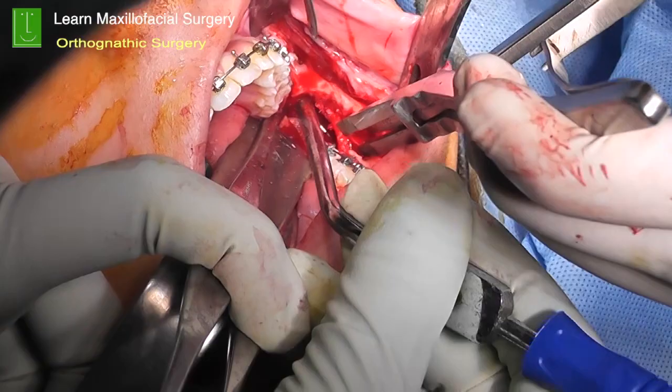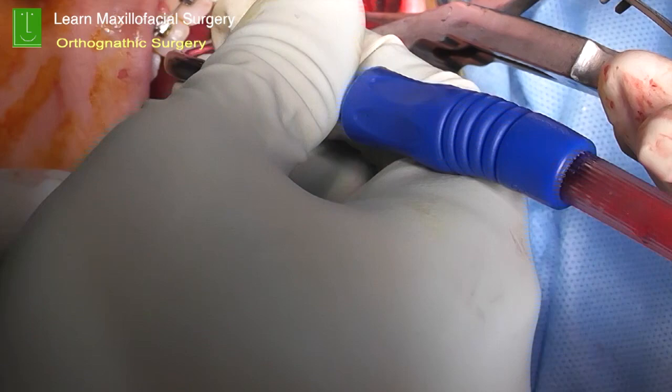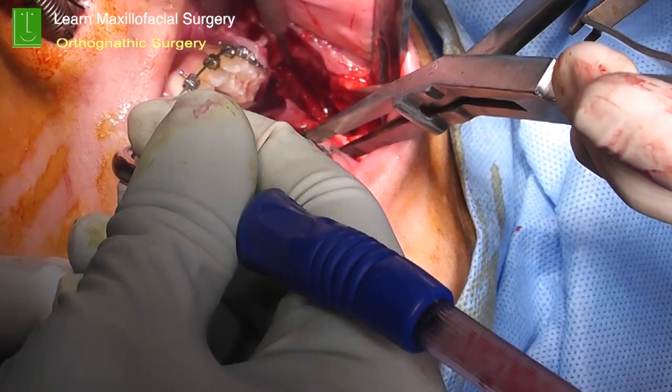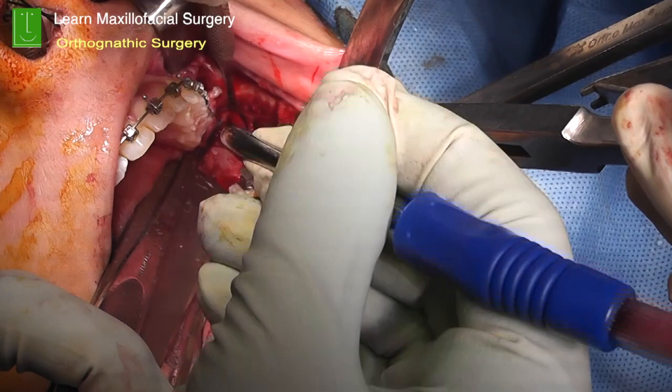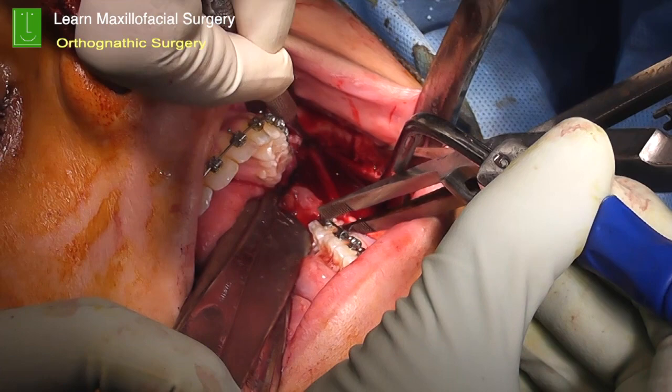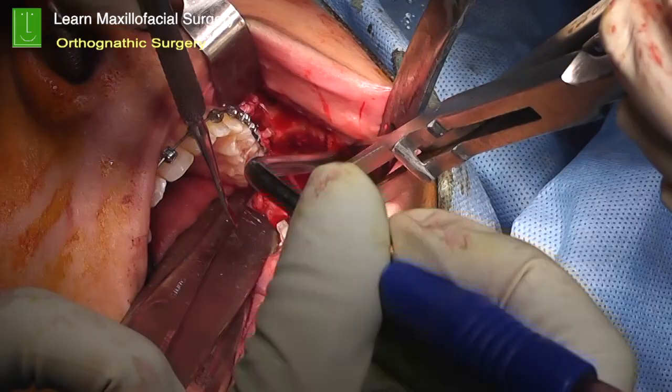Once that's been done, then you can basically use the Smith spreader, and when you do that, you can see the nerve here. The nerve is in the proximal fragment. So it is very, very important that you very carefully dissect the nerve and free it. Sometimes you can have still the bone covering the nerve in the canal that can be very easily pulled out using a fine periosteal elevator, and that's the nerve completely intact, which you can tease out completely and make sure that it is in the distal fragment. That's what you're doing.